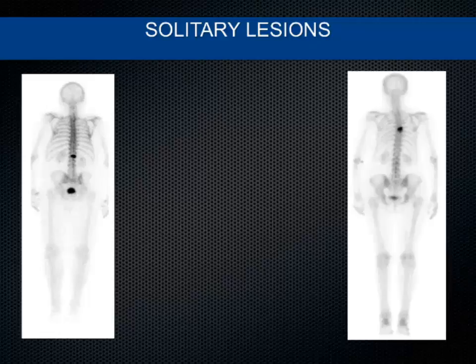In fact, a few hospitals which I know in India have even stopped doing bone scans for prostate cancer patients. They go directly to gallium 68 PSMA because it can show both bone lesions as well as lymph nodes and soft tissue metastasis. So we have to come to an algorithm for how we are going to image a patient, especially in prostate cancer. The research into assessment of these patients is growing extensively, not only from the molecular imaging or nuclear medicine side, but even from the radiological side.